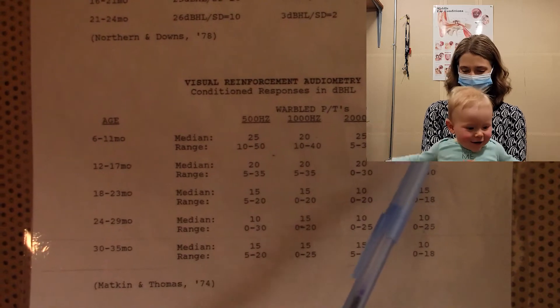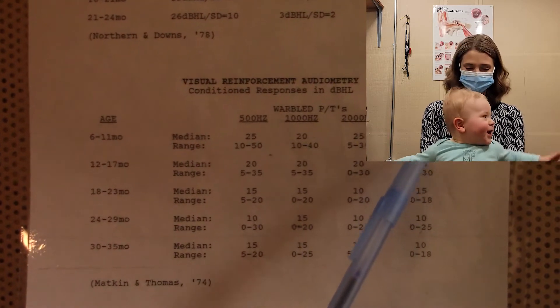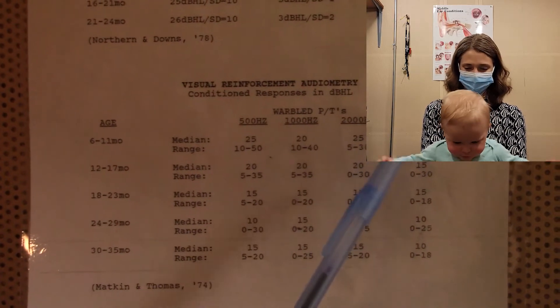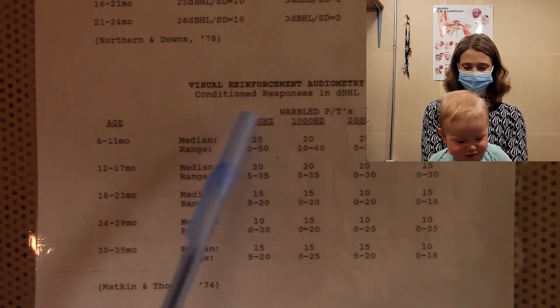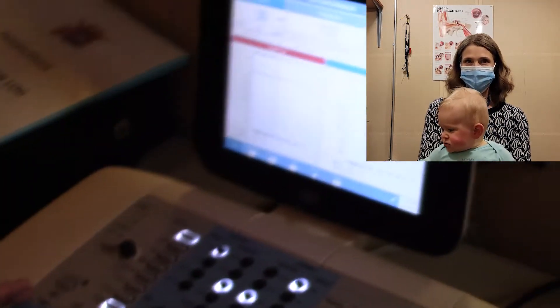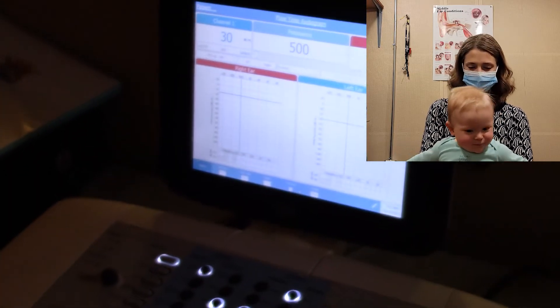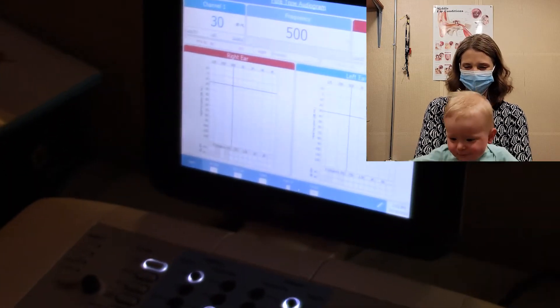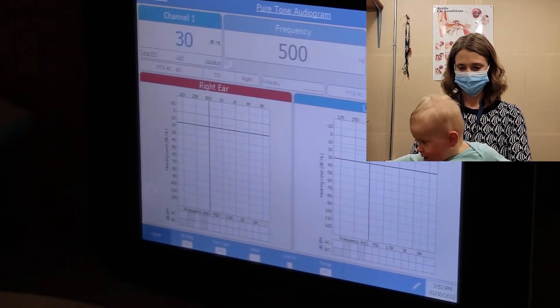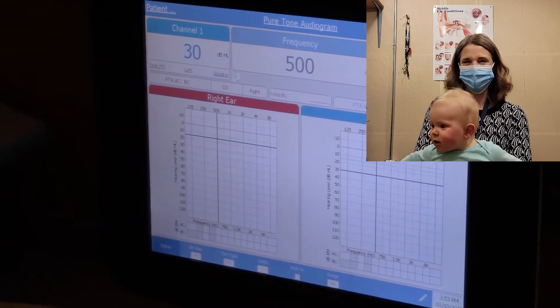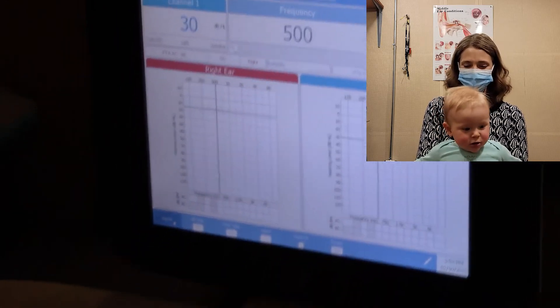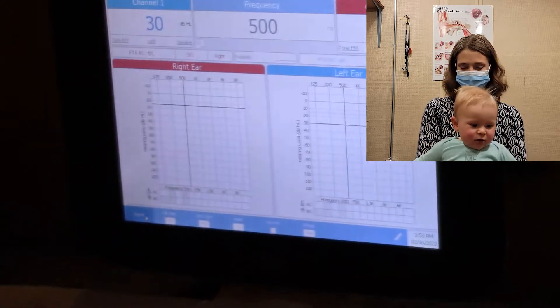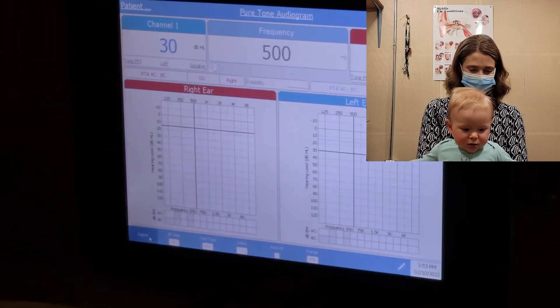I think we can get less. For 6 to 11 months old, the range is at 2,000, 5 to 30 is the range for that age, which we just got him at 2,000 at 30. Speech is 0 to 40. We got him at 10. So he was great there. Let's try 500 and see if just that change of frequency gets his attention. Okay. What do you guys want to use? Should we use, keep it at warble?